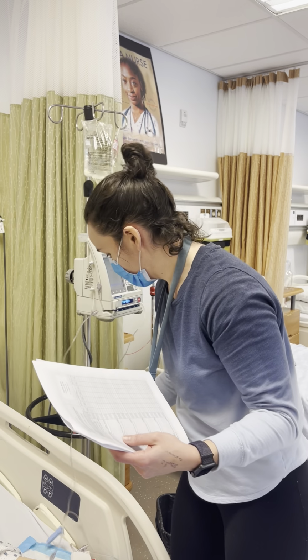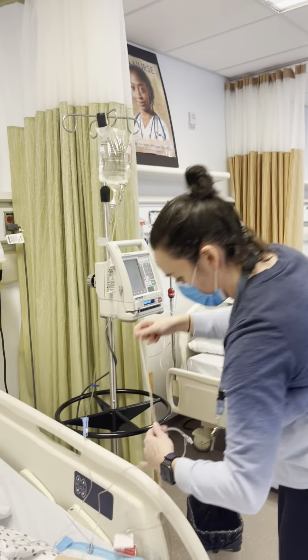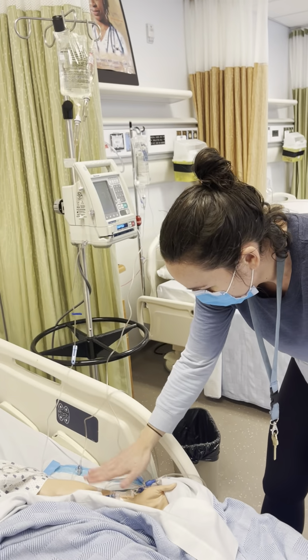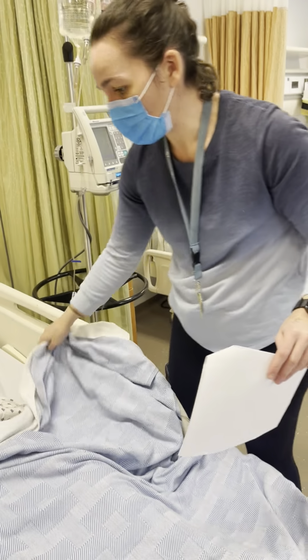And then we'll make sure all of our clamps are open on our carrier bag as well as on our insulin infusion. We've assessed the site already. It's patent, it looks good. He says there's no warmth and no problems with it.